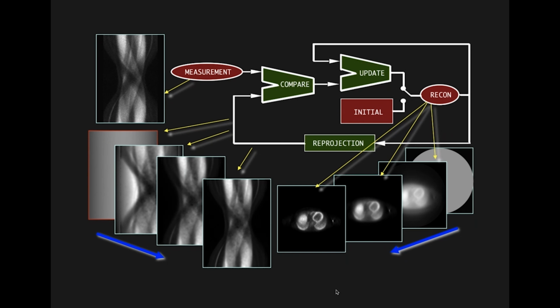Also, it depends again how much time you have. Sometimes you make a quick reconstruction with filtered back projection, and then you have, say, 10 minutes or an hour, and you make the more detailed reconstruction, because if it's not an urgent scan, a radiologist might read the image just the next day or a couple of hours later. But this is for full scans, mostly not real time, unless you really have big supercomputers behind it. So it's again this balance between cost and efficiency.